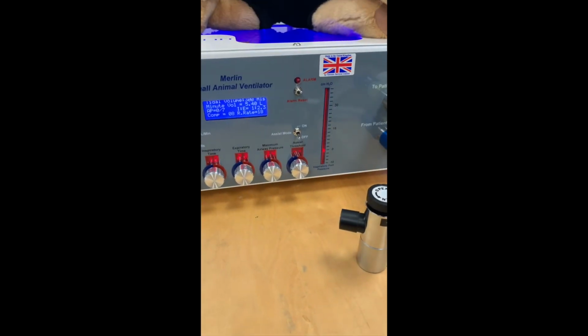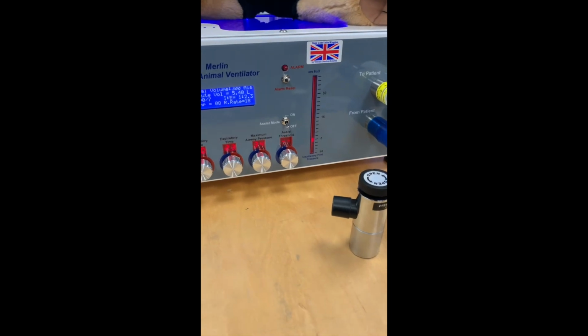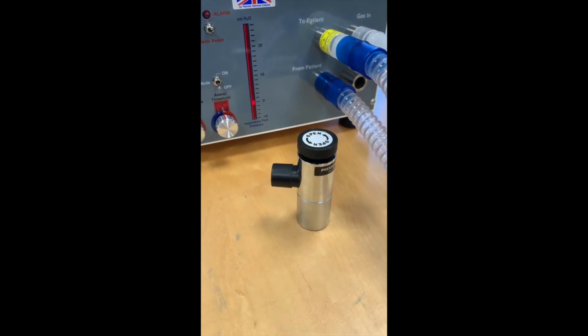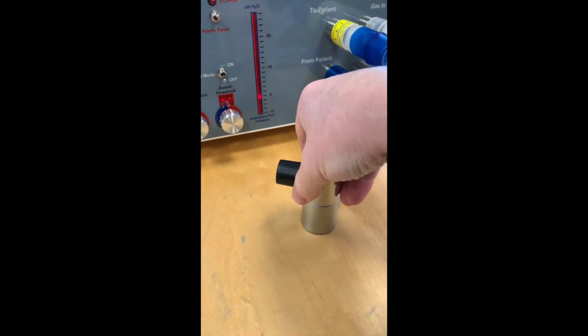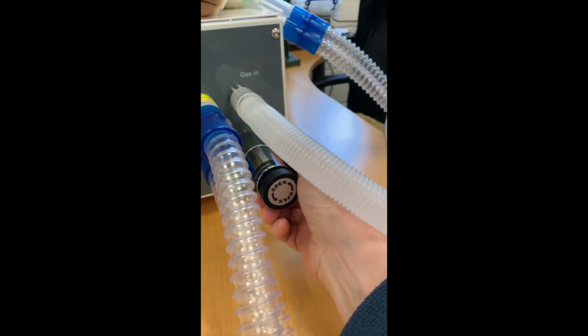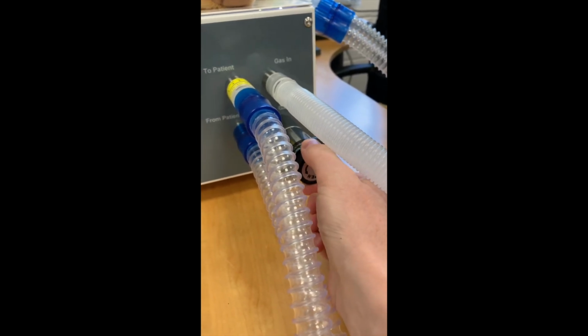The next thing to look at is the ability to use PEEP on the Merlin machine. This is easy to do using our own custom PEEP valve, which is a stainless steel construction and connects very simply to the gas out port by pushing onto that port. And the knob here at the top will control the amount of PEEP we're going to set.